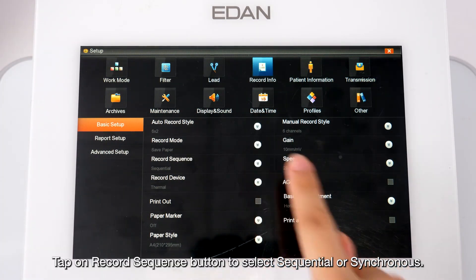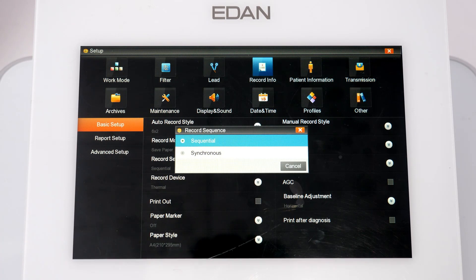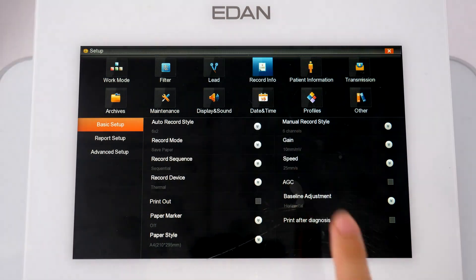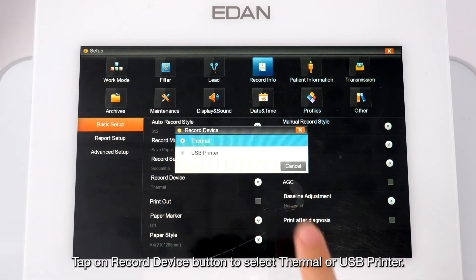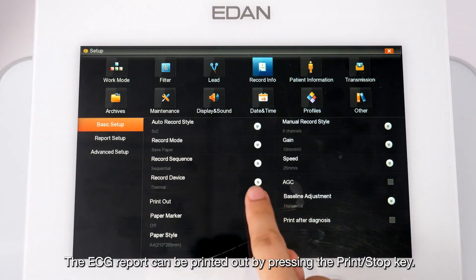Tap the Record Sequence button to select Sequential or Simultaneous. Sequential refreshes lead groups one by one in order; Simultaneous refreshes all leads at the same time. Tap the Record Device button to select thermal or USB printer. Enable Printout so the ECG report can be printed by pressing the print or stop key.